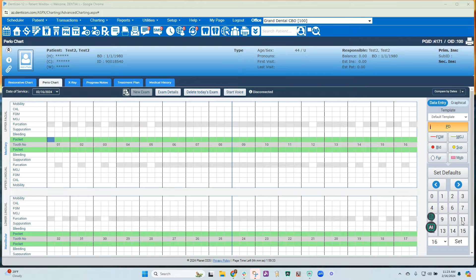I will be giving a demonstration on VOICE, the periodontal charting system created by Denti AI.